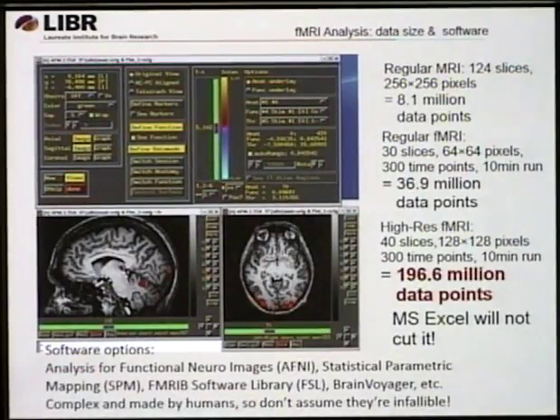Okay, I may skip that because, bottom line, we're getting a lot of data from our experiment. Per subject, typically we're getting about 2 gigabytes of data, but we are about to start a study on kids, and we will be getting 130 gigabytes of data per subject. So there's a lot of data, and we actually have to deal with that.